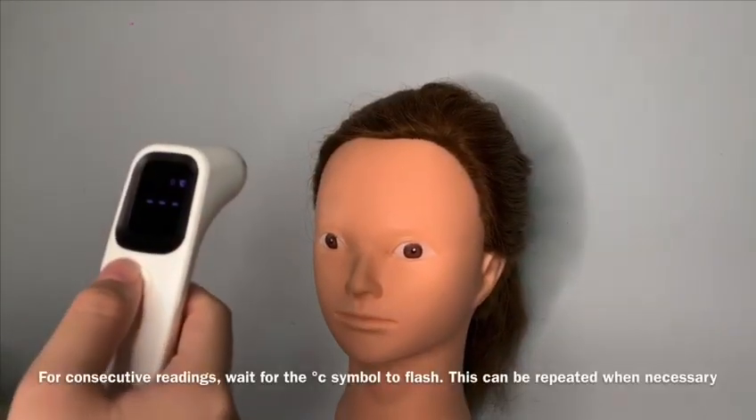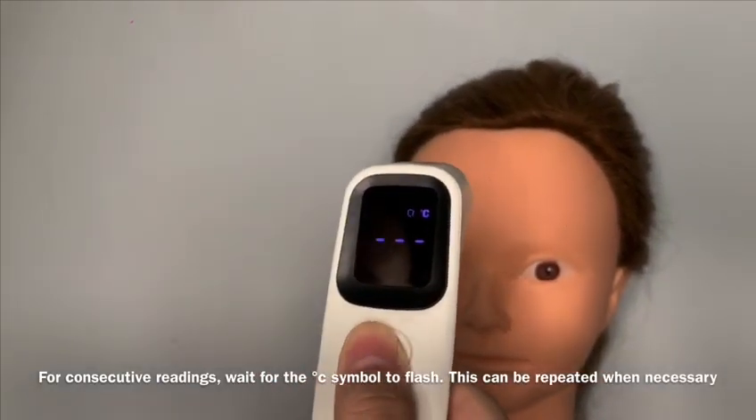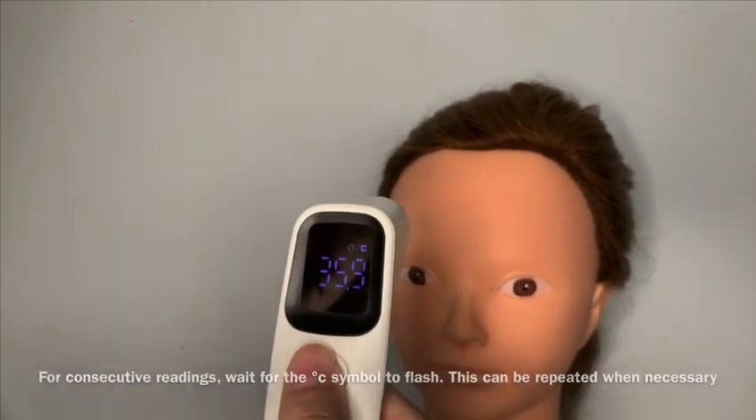For consecutive readings, wait for the degree Celsius symbol to flash. This can be repeated when necessary.